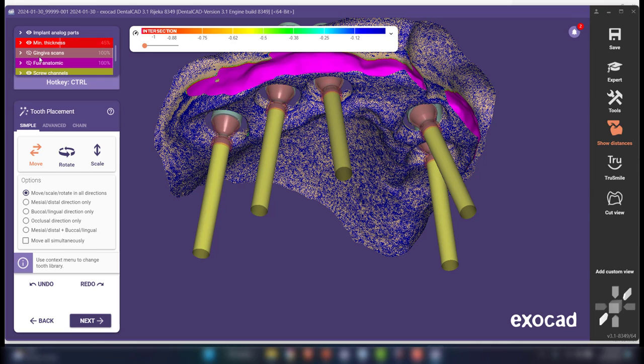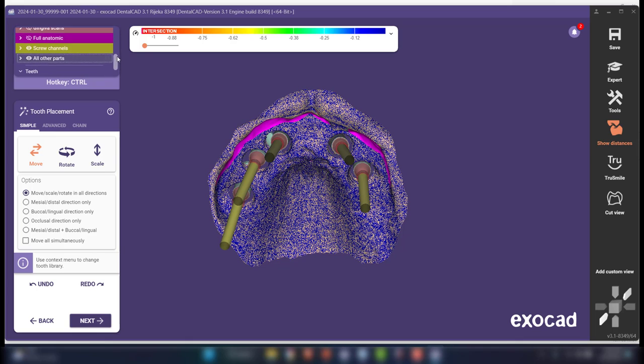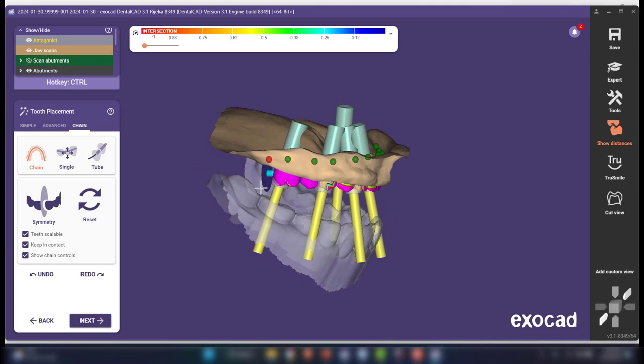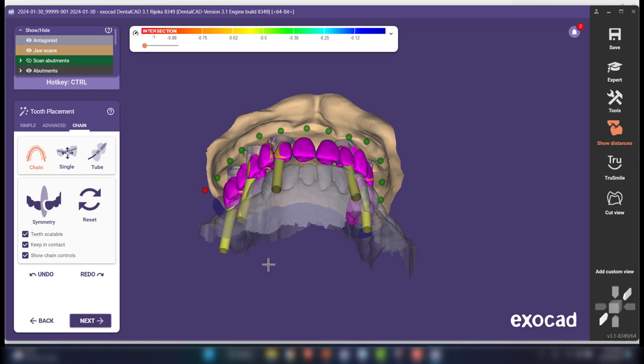I'm not going to go through the design process here because chances are you've done that before if you're getting to this point. You could refer back to the last video I did on the Grammee scanner, which does show the design there. I converted a wax up, or you could just, once again, go back and just do it right from this. You could start setting teeth against the opposing. That's not really what I was after in this tutorial. I just wanted to show you how to integrate this data so that you could bring it in and correct the intraoral scanner and make up for the built-in inaccuracies that are going to be inherent with that and utilize this Grammee data.